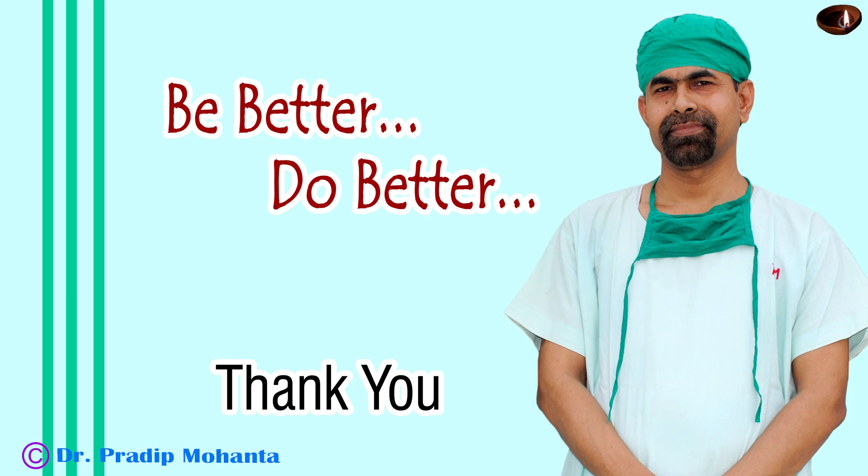Thank you very much for your attention. Hope this video will help you in developing your surgical skills. Hope you will get inspired to use a pre-chopper. The pre-chopper I have used is designed by Dr. Suhail Irfan Khan. You can use this pre-chopper or any other pre-chopper of your choice. But this is a good instrument and should be in your surgical armamentarium, so that you can manage soft cataracts very comfortably.